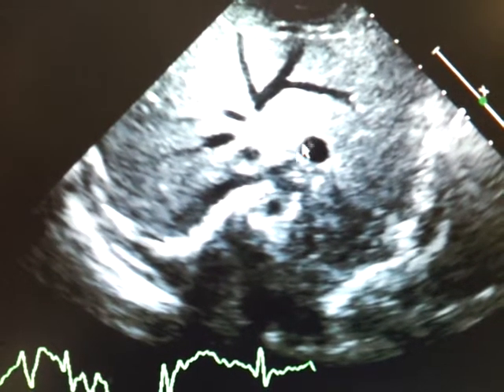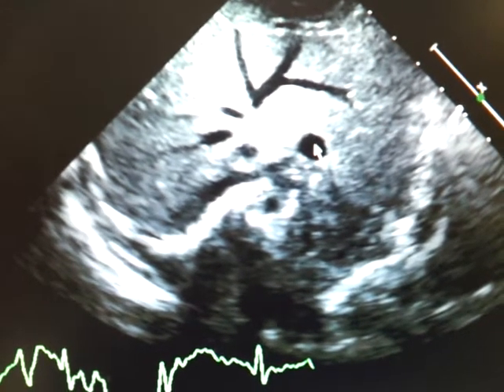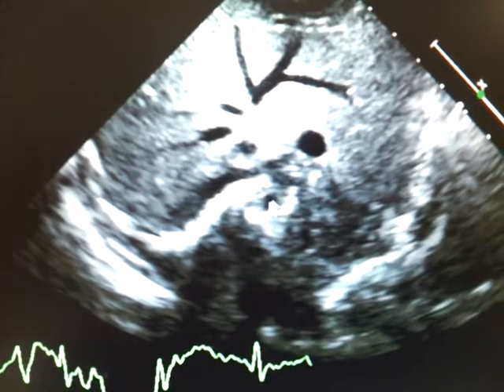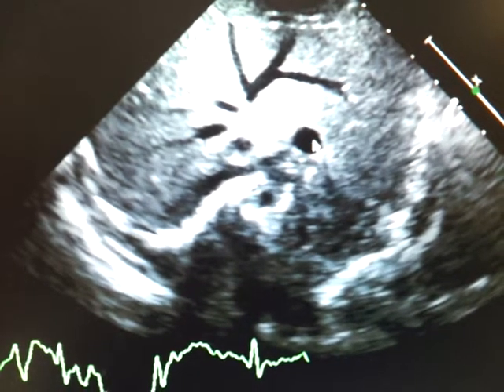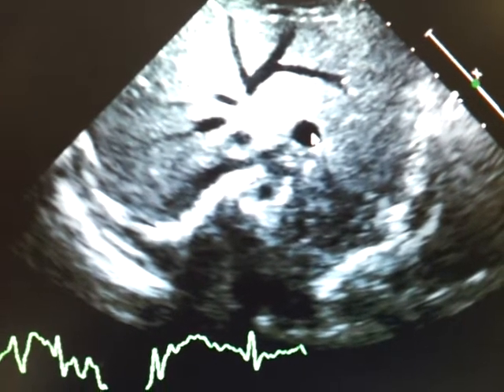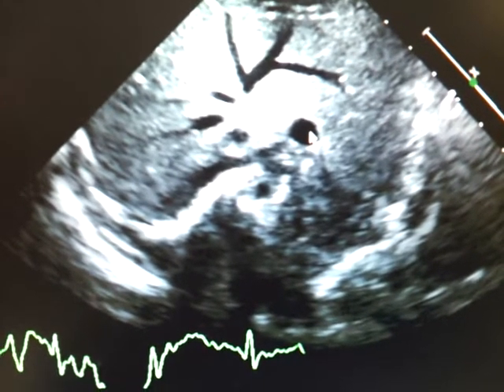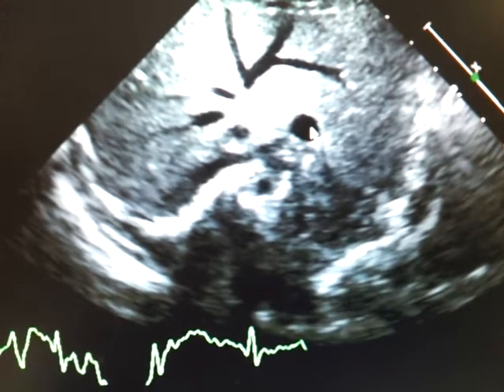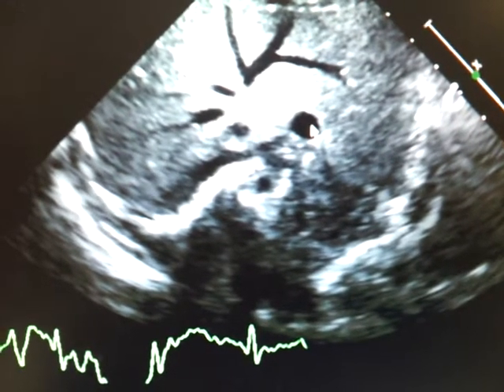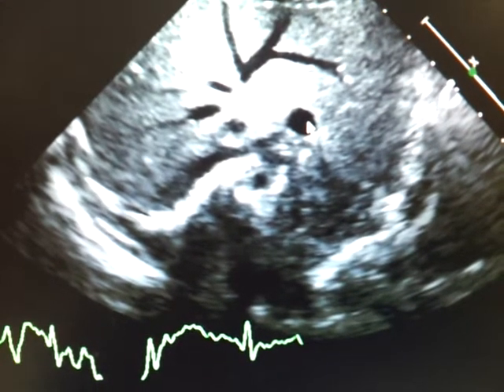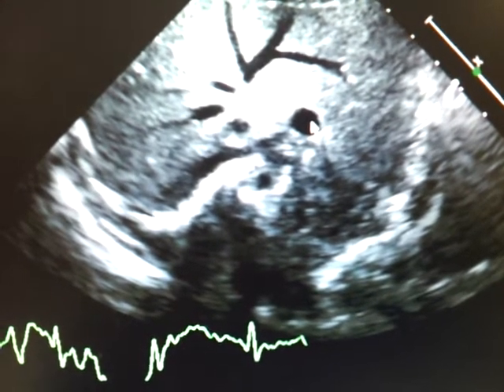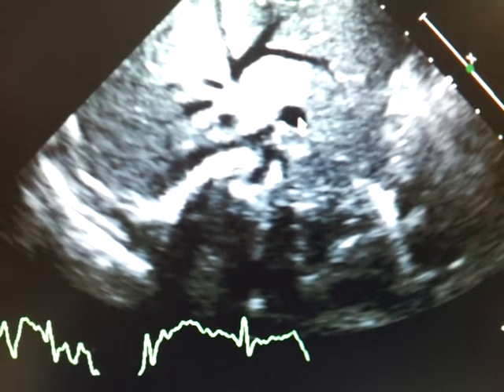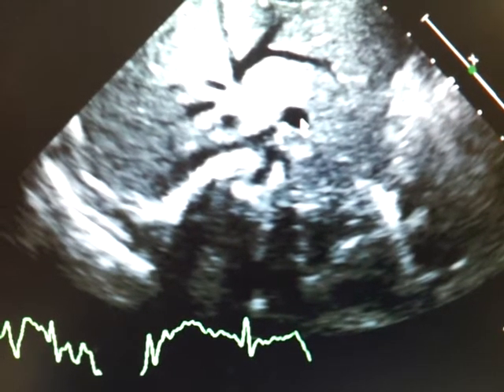This can fool you — the aorta is right here. This is the vessel, or vertical vein, that's actually draining the pulmonary veins from the left heart to the IVC. Total anomalous pulmonary venous return.